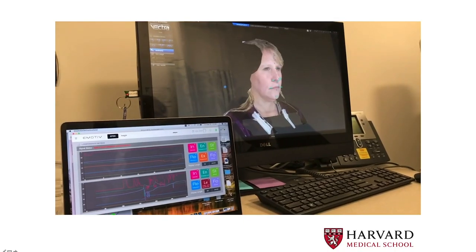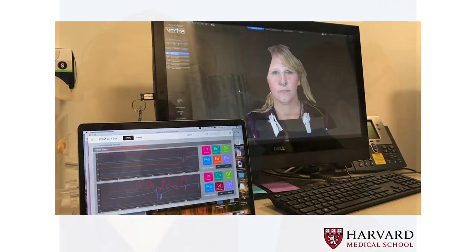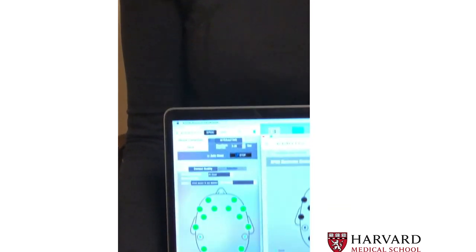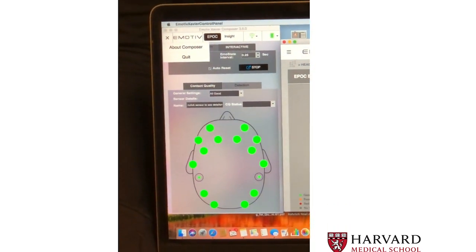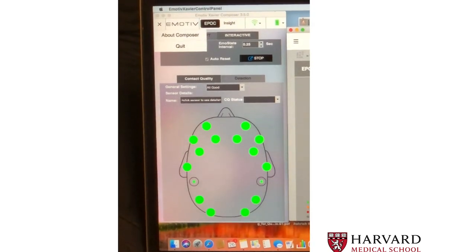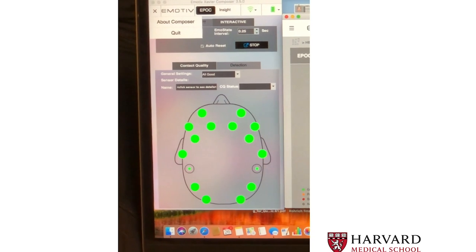At Mass General, we put this device on patients using the VECTRA 3D to see how they're responding to different changes. This is how the device is worn — it's a Bluetooth device. Eric is here and we're going to demonstrate how this works. The device is connected and on, attached to our computer screen through Bluetooth, and we can see all the channels are connected and working well. We'll go ahead and take her pre-op photo, change it, and see how she responds subconsciously through her EEG.